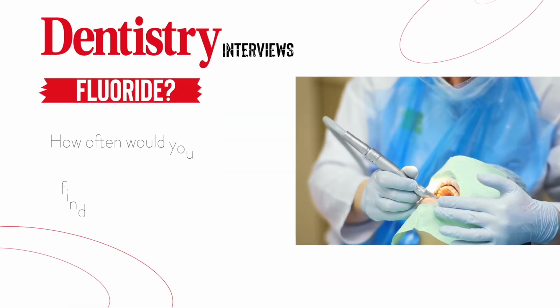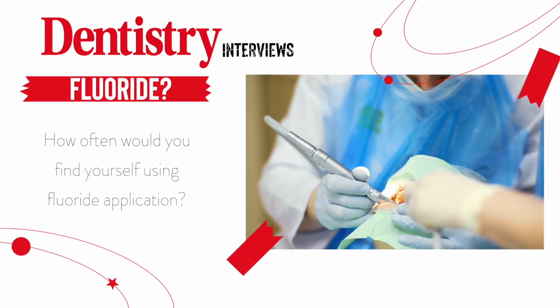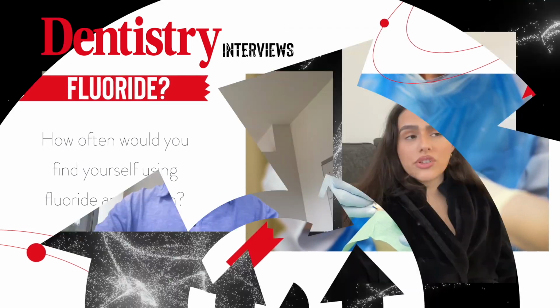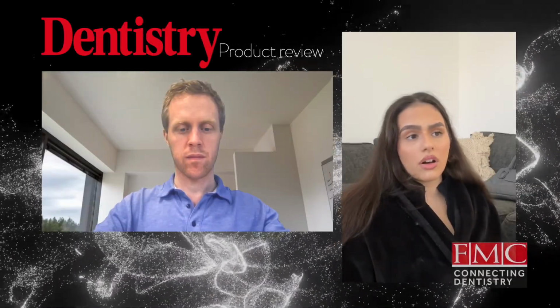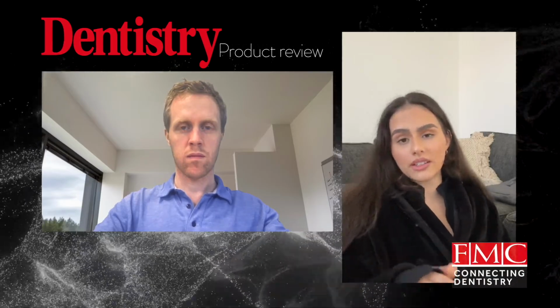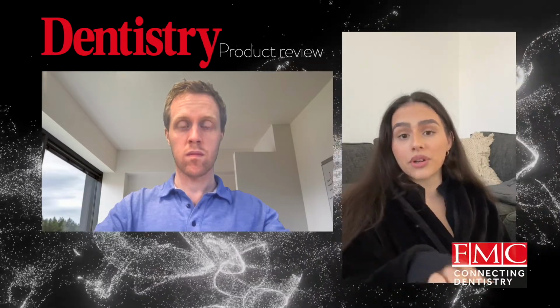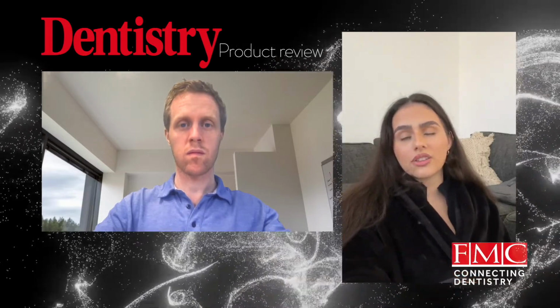And you say really frequent hygiene appointments. How often would you find yourself using fluoride application? At the moment, I'm finding it a bit difficult including it, just because of dentists remembering to put a prescription into the notes.